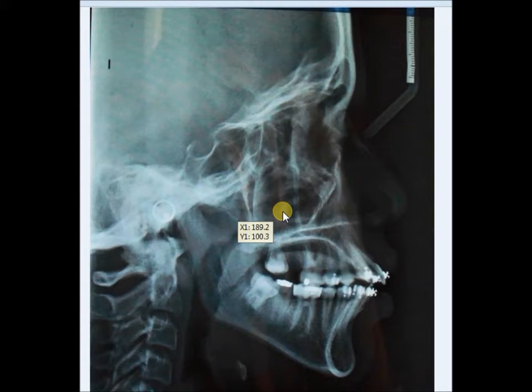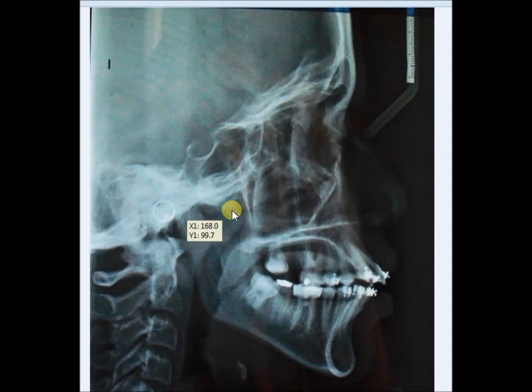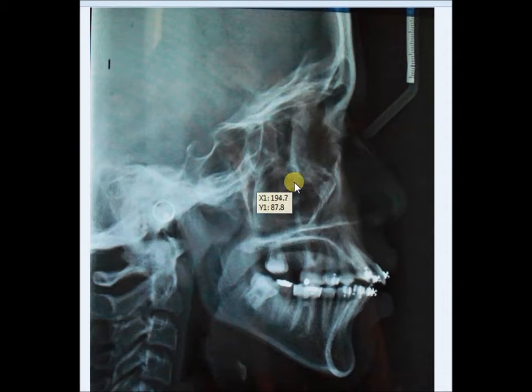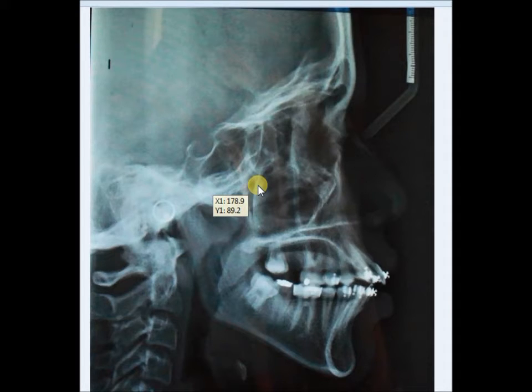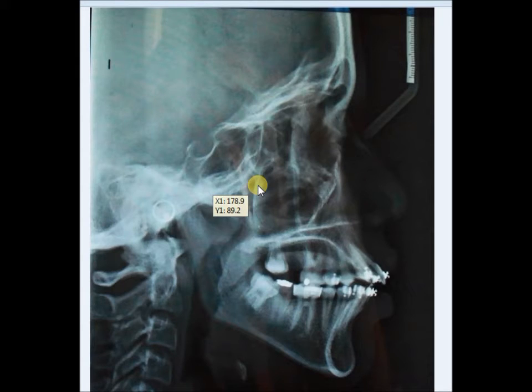If you want this software, you will have to take up our Level 2 course onwards. We are now going to show you how you can measure angles, lines, planes, and distances — so almost all the analysis you can do using the free cephalometric software that comes with the Academy of Fixed Orthodontics courses.